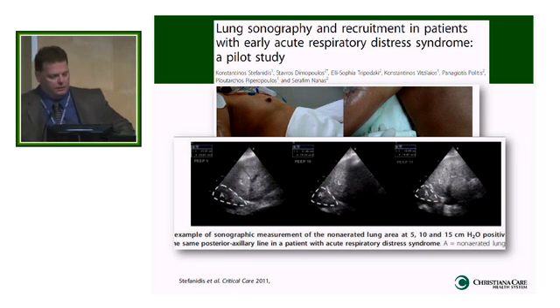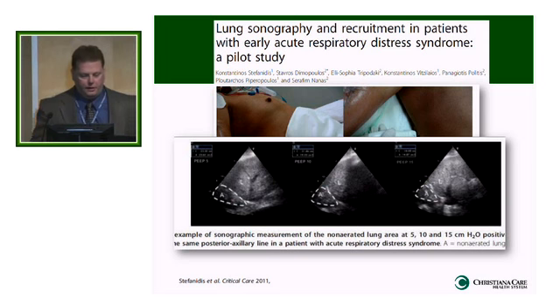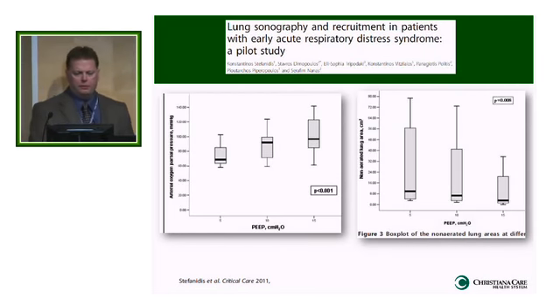And it's very limited because you can only see so much of the lung with ultrasound without other things being in the way. But what they did find is that if the ultrasound person said, yeah, you're recruited, the oxygenation got better with the maneuvers they did. And also the non-aerated lung: when they said there's less atelectasis, they found that there was less atelectasis as you went up on PEEP. So the point being, they were able to monitor PEEP with ultrasound and see if they were recruiting the lung tissue of the patient.